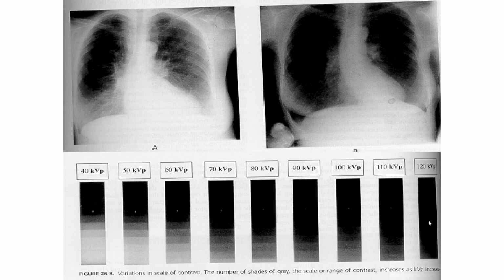Alin ang may high contrast? Yes, sir. High contrast, letter B. Low contrast, letter A.